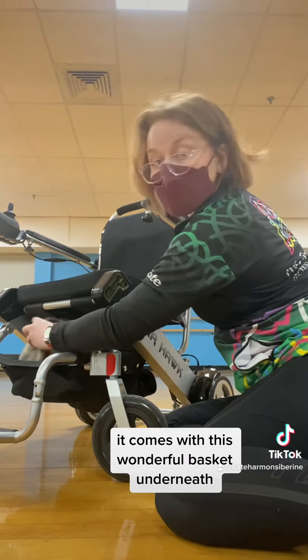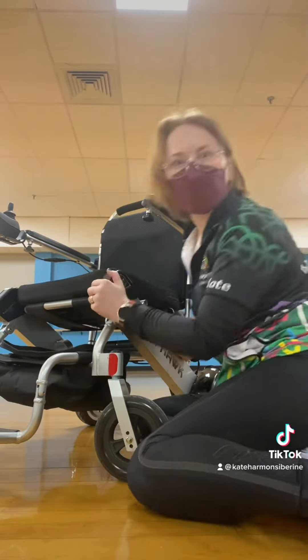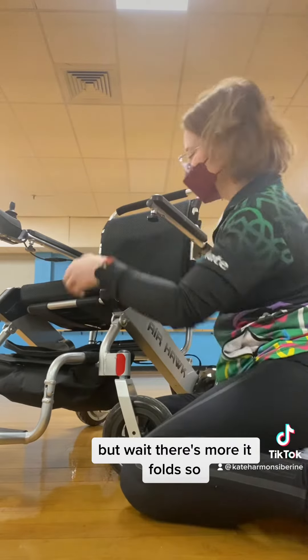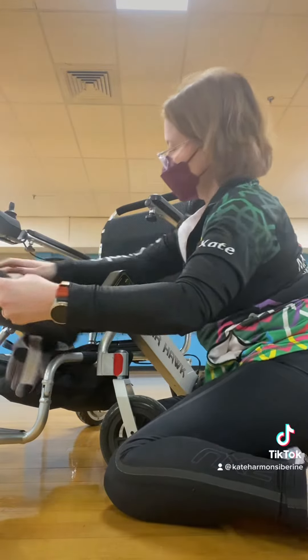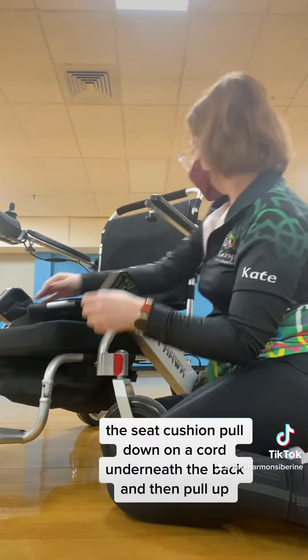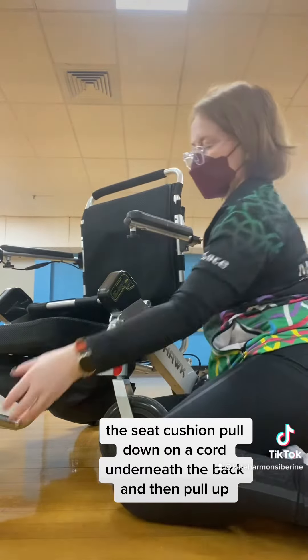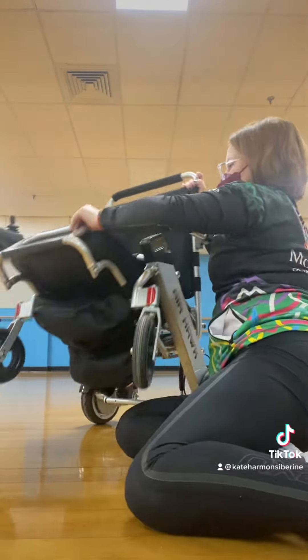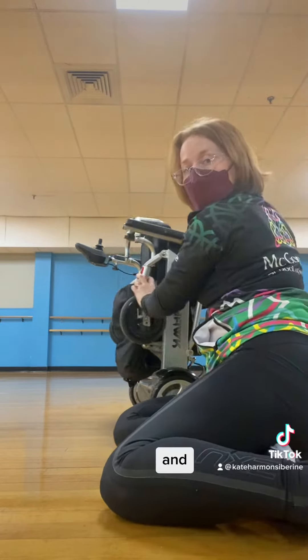It comes with this wonderful basket underneath that I am currently using to hold wintry things. But wait, there's more — it folds! Take off the seat cushion, pull down on a cord underneath the back, and then pull up on the footplate. And ta-da!